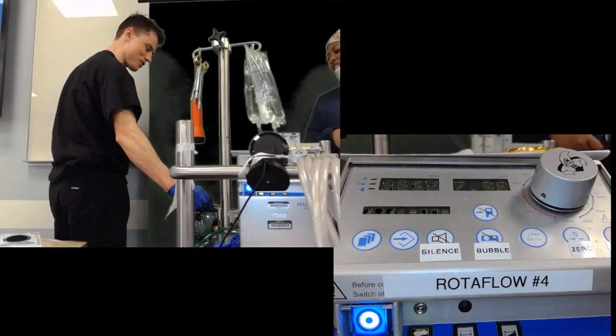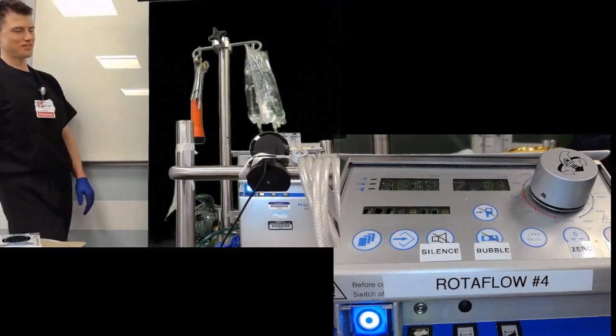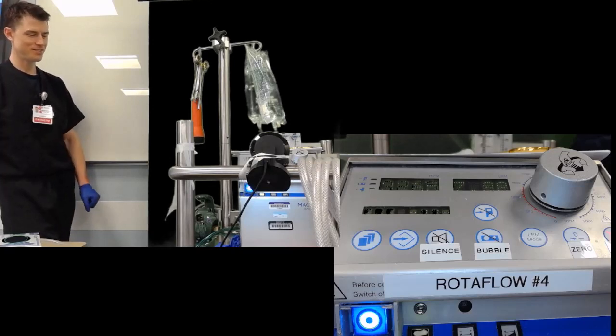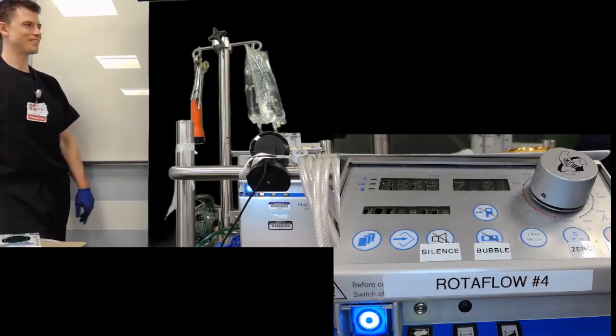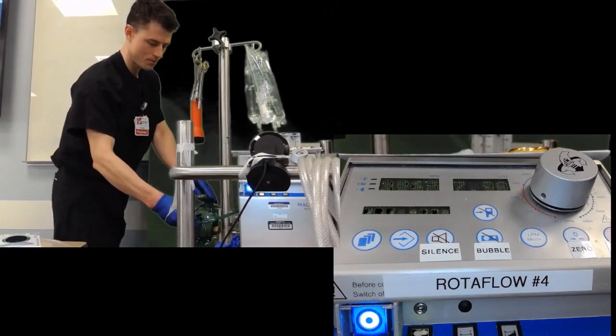Sorry about that. All right, so now your oxygen's on. Still nothing's happening. You hear it going. Oh, yeah, it's not connected. Okay, yeah. Right here, right? So our green line here. So we're gonna hook it up.